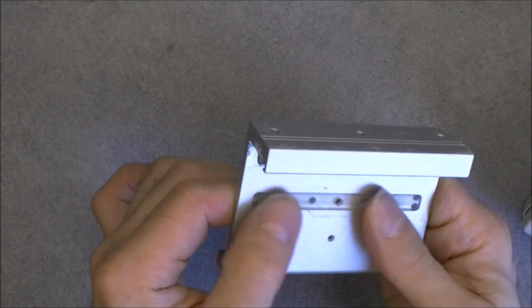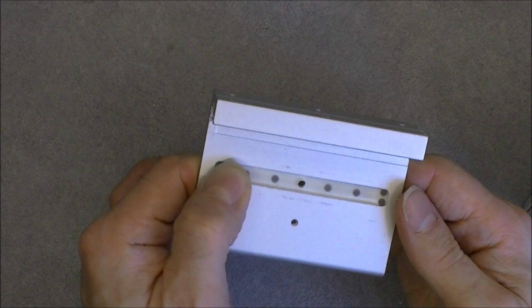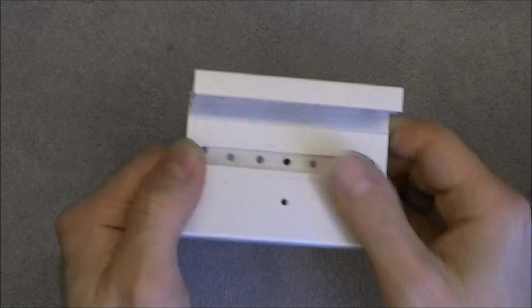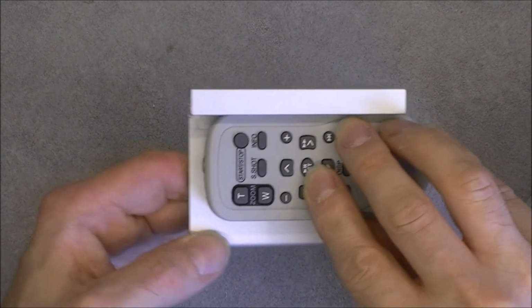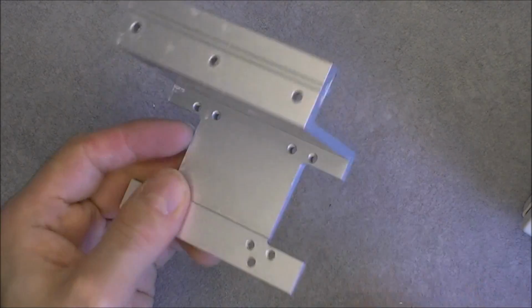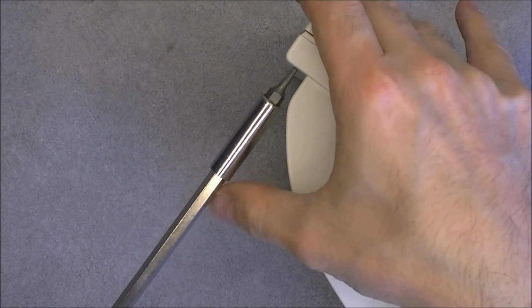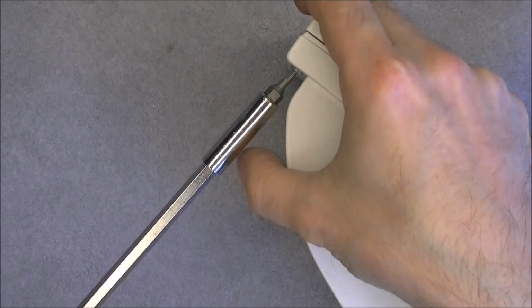And there is some rubbery insert here. I believe it is to prevent it from sliding sideways when it is mounted on the X-ray table. Little bit filthy. Okay, I am left with 3 other screws, and we will be able to discover what we have inside.